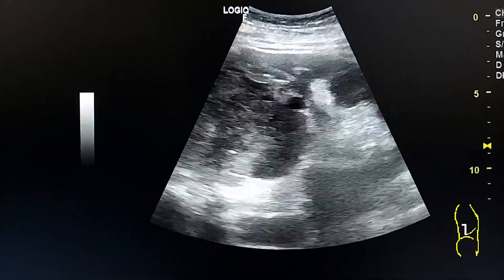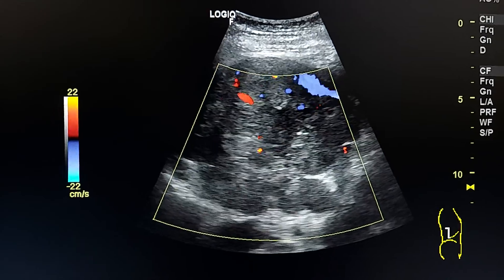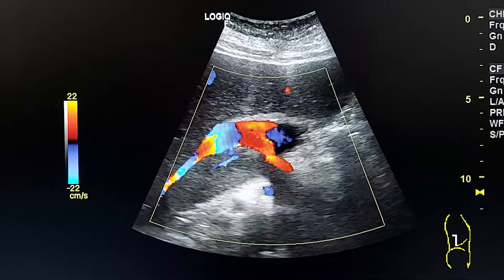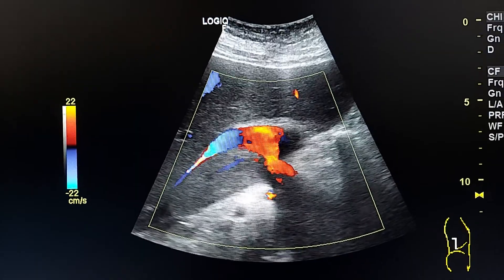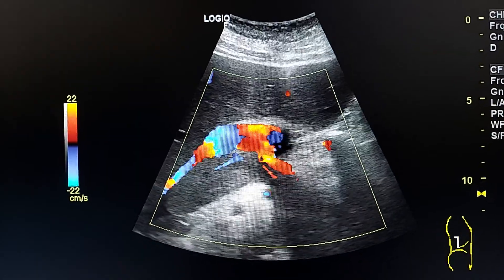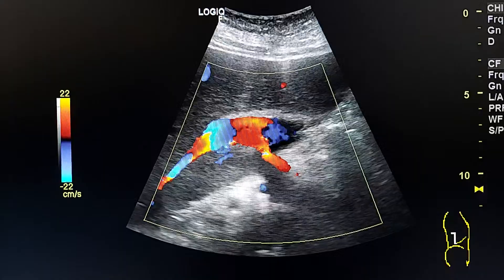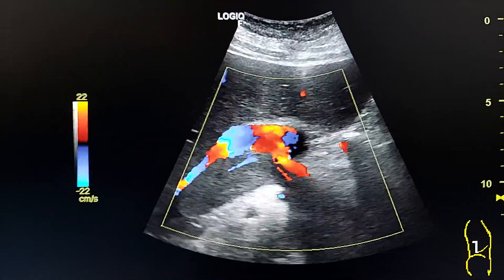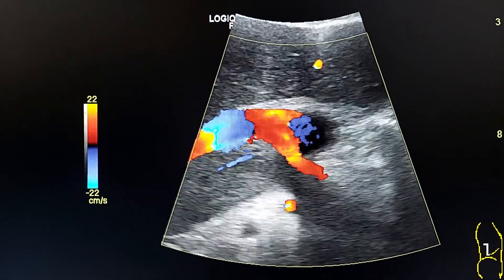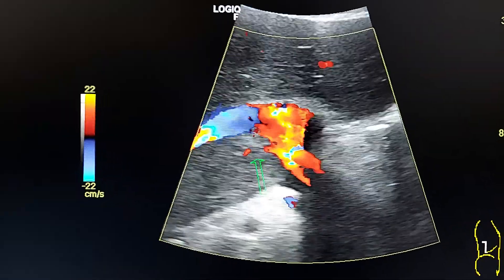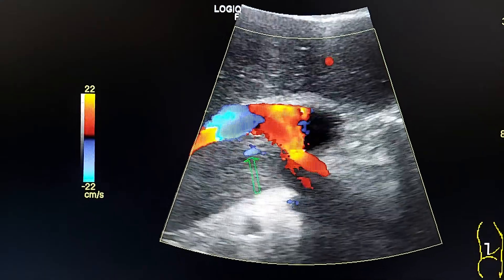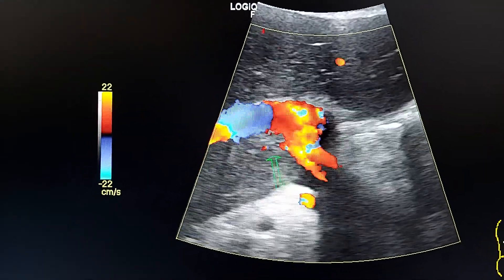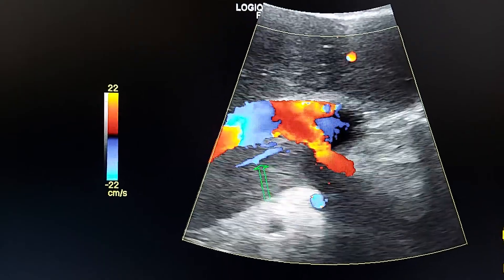The mass is in the upper pole of the left kidney. No metastasis was seen in the liver. To summarize: large upper pole left renal mass with a mass lesion inside the IVC, with internal vascularity detected by color Doppler, which confirms malignancy.